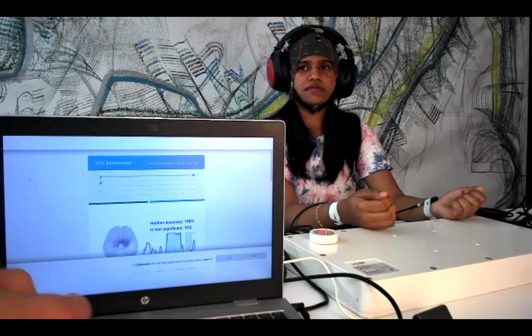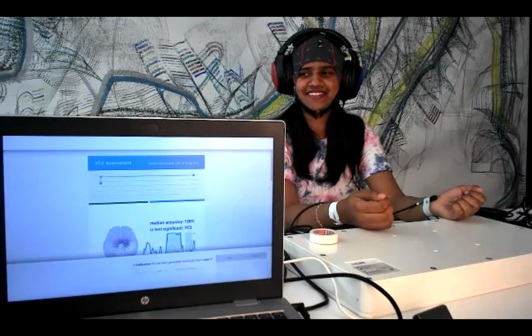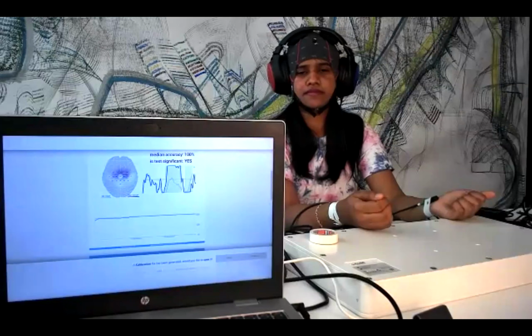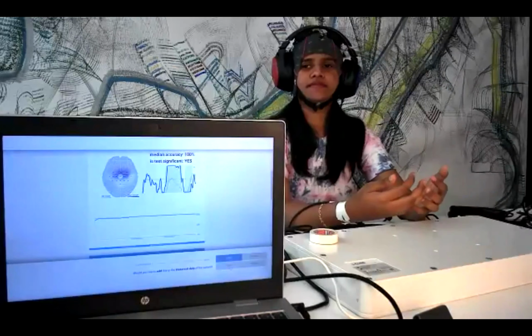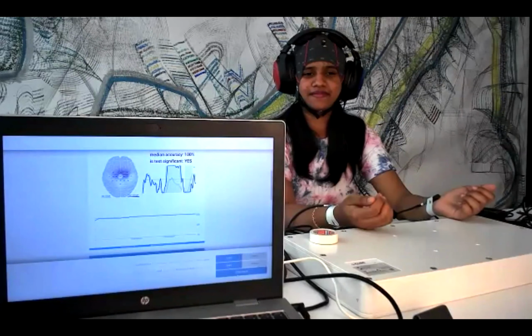Okay, great. Again, 100% perfect. Great job, Vaishali. So we can see the very large amplitude of the ERP. It's perfect. And also accuracy, you see, it really starts with a single trial already above 90%. So it's really great ERP. And here I will just save the data. It's perfect data. Of course, I need to save it and also add to the historical data. And I can continue.